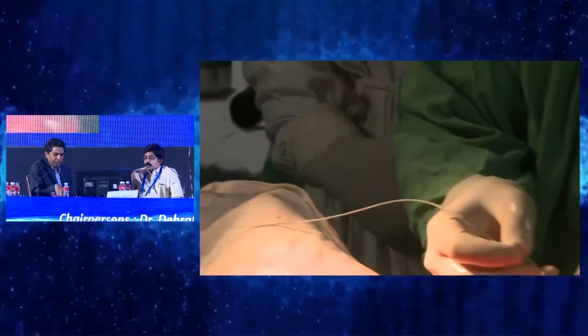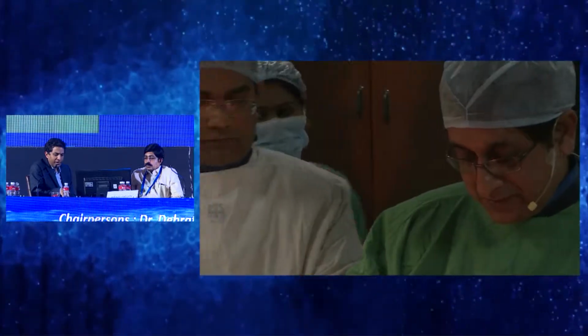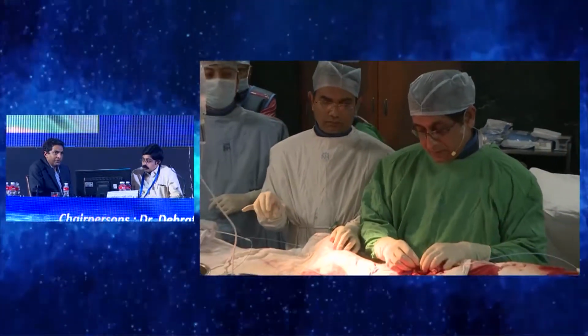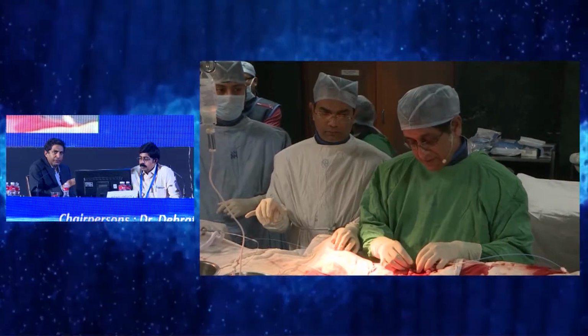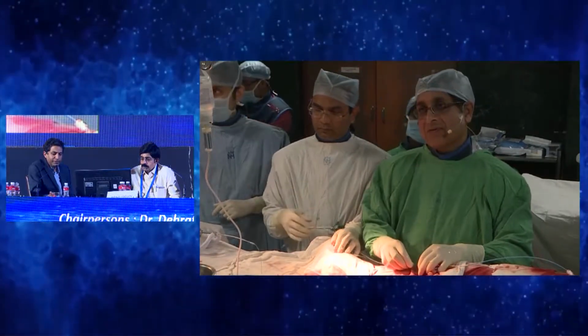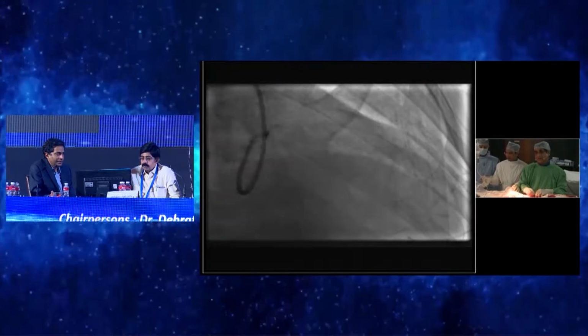We can actually see where the vessel, the proximal and distal cap are, and we can assess by that how to approach the CTOs easily. And also by using microcatheters and equipment, and rapidly changing from antegrade to retrograde approaches, we are able to shorten the time we take nowadays for CTO PCI. You agree with that? Yes, I totally agree.